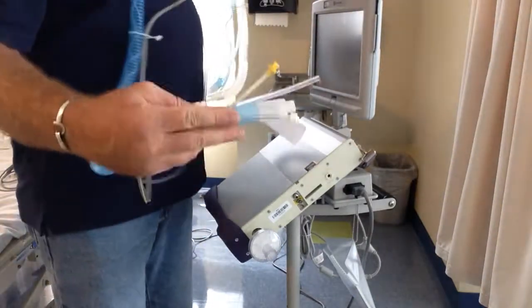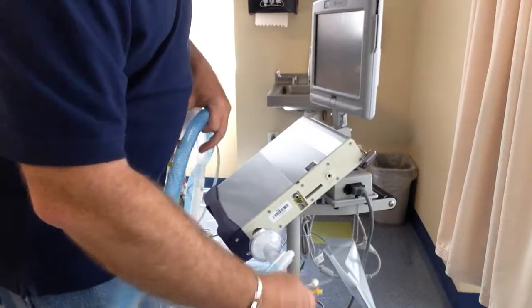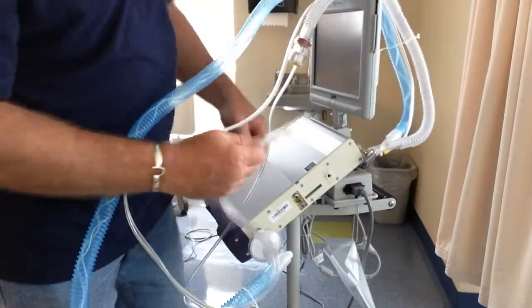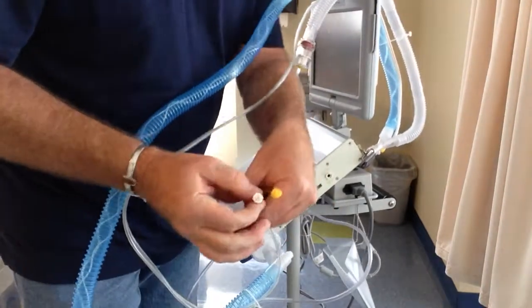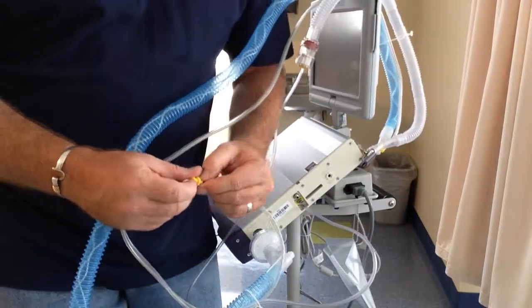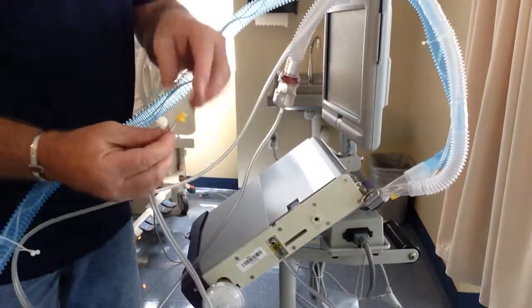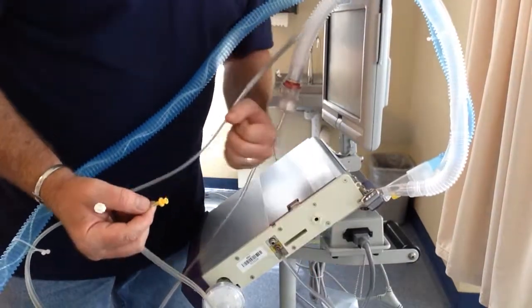Blue, as we said before, is inhalation — that goes there. You have your three connector hoses right here. One is a push-on. If you look, the ends are different, so you cannot cross them up unless you take them off and put them together — don't do that. The yellow connector goes into yellow; it is color-coded.